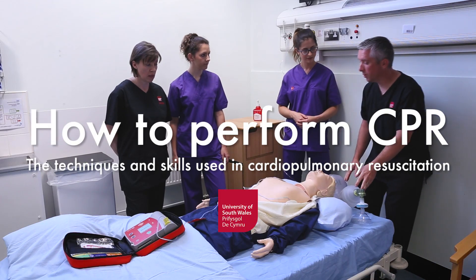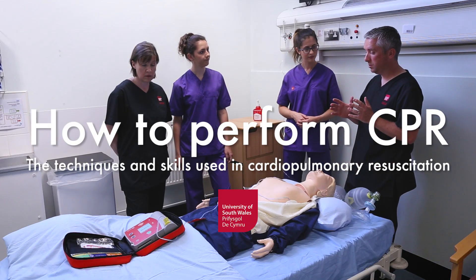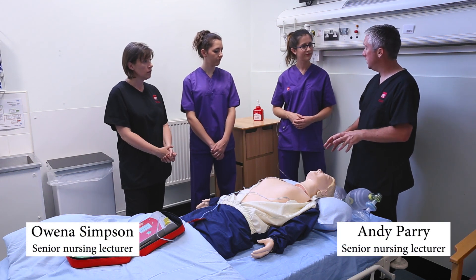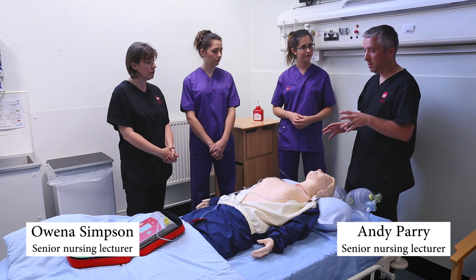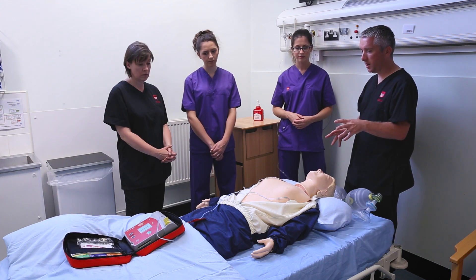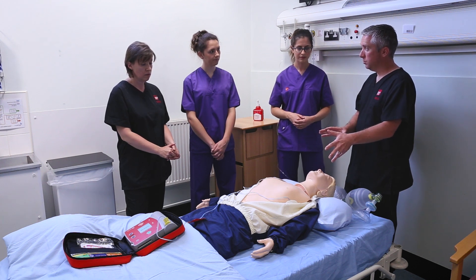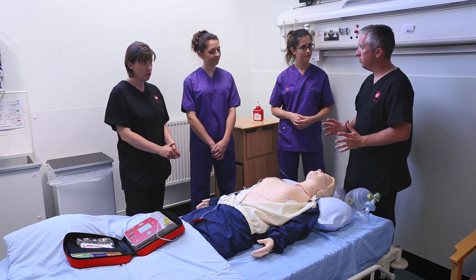In this session we're going to teach you about performing CPR correctly on a patient in cardiac arrest and how to maintain their airway and ventilate them. We've set up this mannequin so they are in full cardiac arrest and the defibrillation pads have been attached, so we're just going to carry on from there.